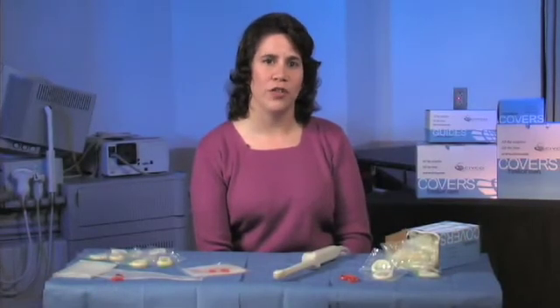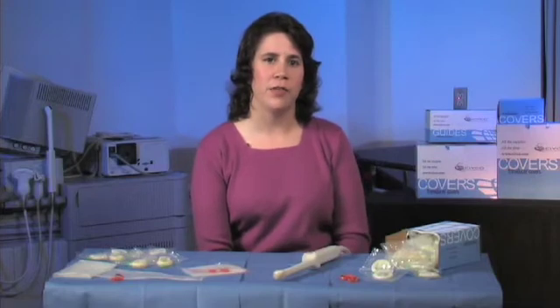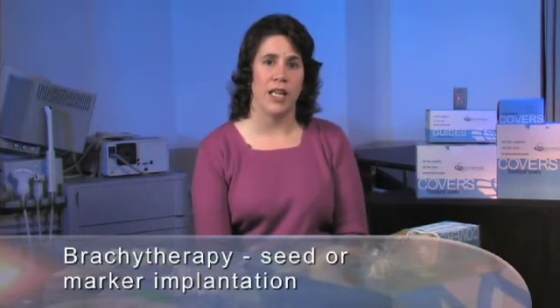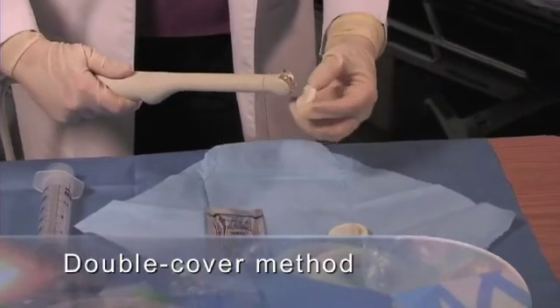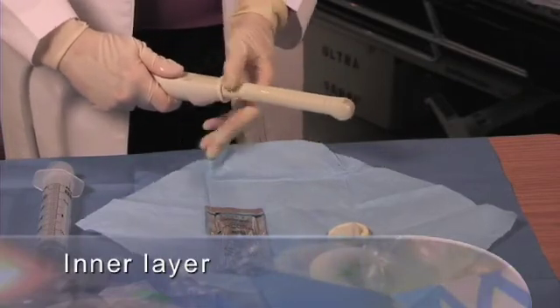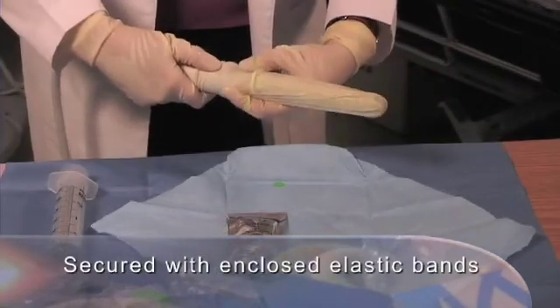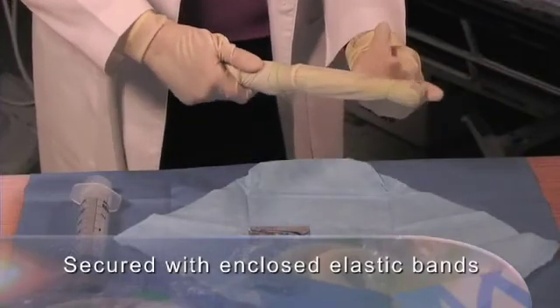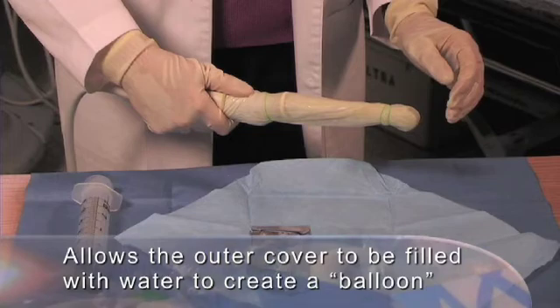When performing a transrectal ultrasound, there are several types of transducer covers available. Transrectal ultrasound is an invasive procedure that may involve tissue biopsy or brachytherapy, seed or marker implantation. Some transducers use a double cover method to create a balloon or water bath through which to scan. This involves placement of one cover that forms the inner layer. This cover must include the gel covering the transducer face. Both the inner and the outer cover are secured to the transducer with enclosed elastic bands. This allows the outer cover to be filled with water to create a balloon that will displace any air between the cover and the wall of the rectum.